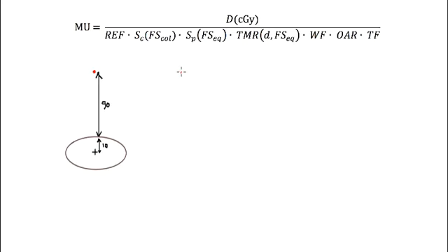All right, so let's consider a slightly different setup here. Same isocenter, but the patient now is set up down here at an extended SSD, here 110 cm. And again, I want to calculate the dose at that point, which is the same point, a depth of 10 cm in tissue, but now it's not at isocenter anymore. So how do I do that?